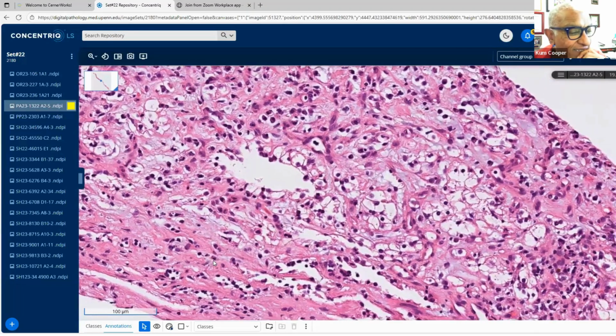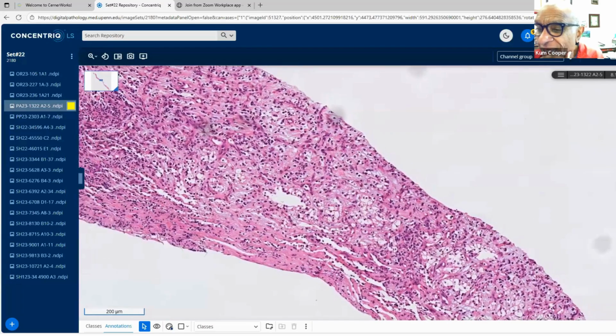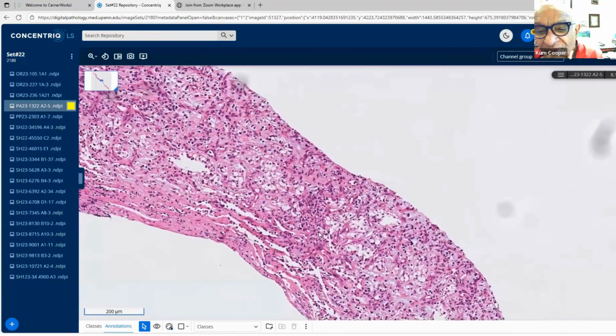How about this area here? There we go. There we go. We're getting it now. Clear cell carcinoma. Yeah, exactly. Nest of clear cell carcinoma. Thank you. For the moment, I thought I was being a little delusional there. But anyway, if you do a keratin, these light up. These islands light up here. Okay. And these are all keratin positive. Yeah, you can see a few more here on this side.